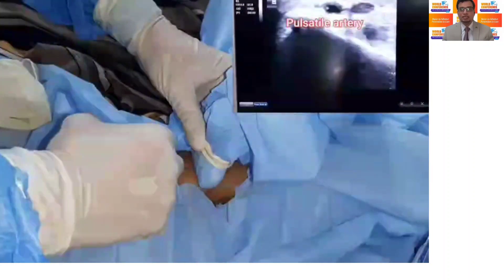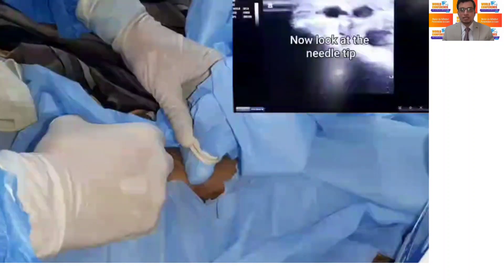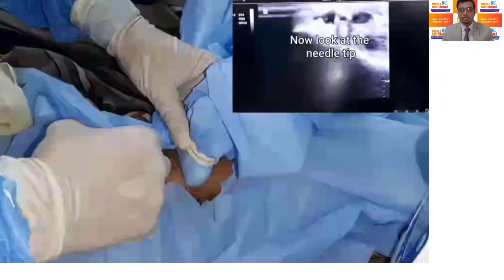Out-of-plane approach is easier to learn and quick. In this method, the long axis of the probe is perpendicular to long axis of the artery in such a way that a transverse section of the artery is visualized on the ultrasound screen.